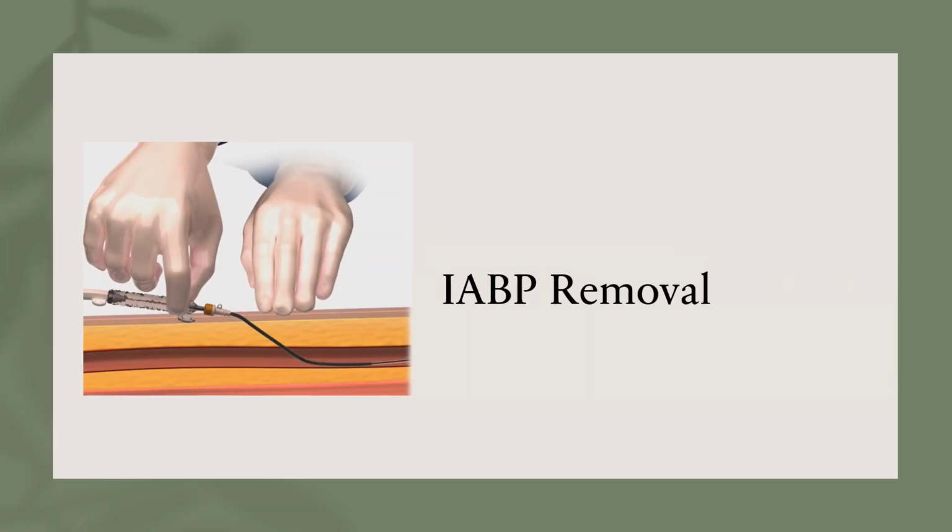Successful removal of the intra-aortic balloon pump depends on an adequate weaning procedure and assessment of the patient, and usually over a 12-hour period, as we mentioned before, is better for balloon removal in high-risk patients. We should assess the distal circulation several times before and after balloon removal, and periodic assessment of distal circulation is recommended after the removal of the balloon.